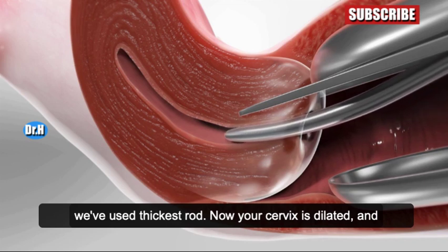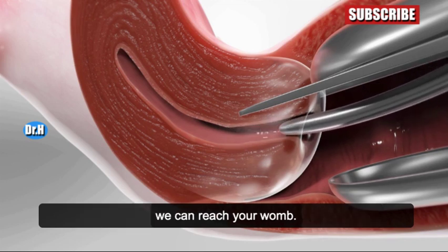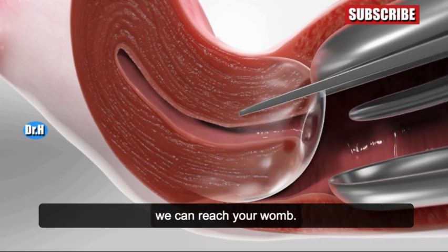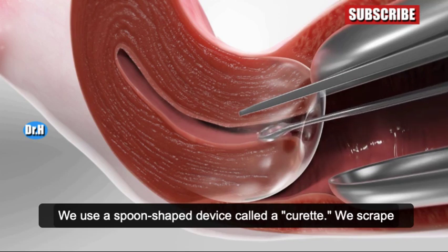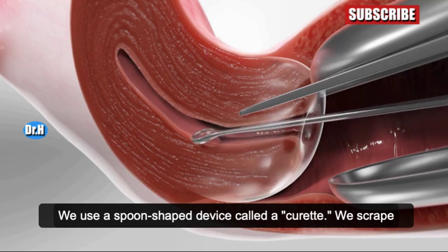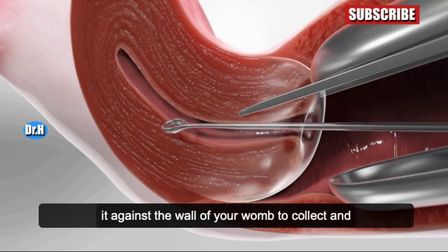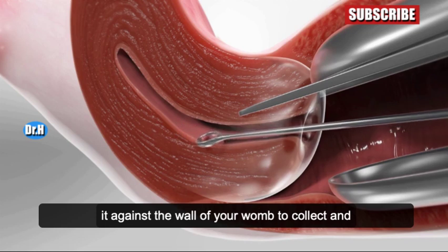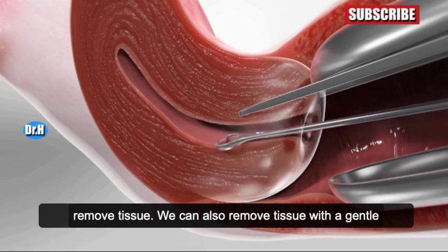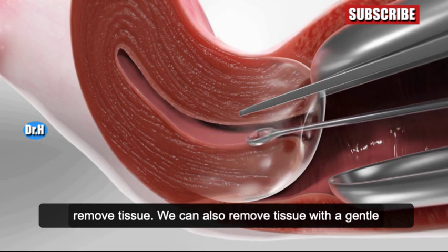We use a spoon-shaped device called a curette. We scrape it against the wall of your womb to collect and remove tissue. We can also remove tissue with a gentle suction device.